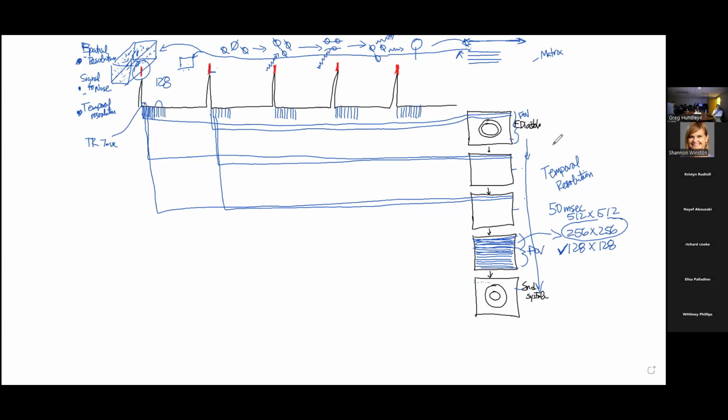We call it phase. Each one of those little lines is a phase encode, and we can do something called phase encoding grouping. Okay? And so that allows you to group and get several pieces of information in that window of time so that you are getting multiple lines with each heartbeat.